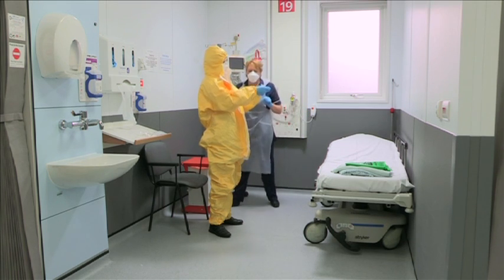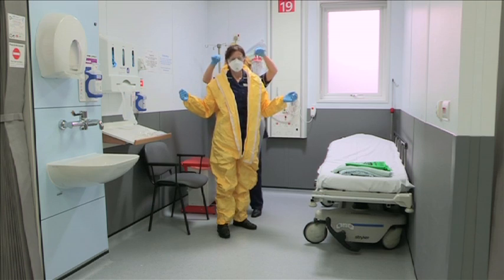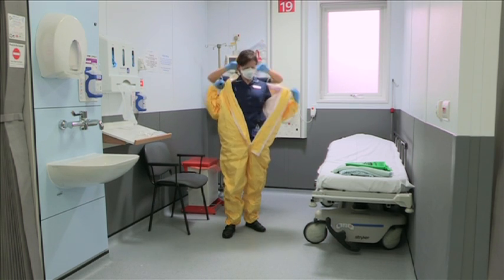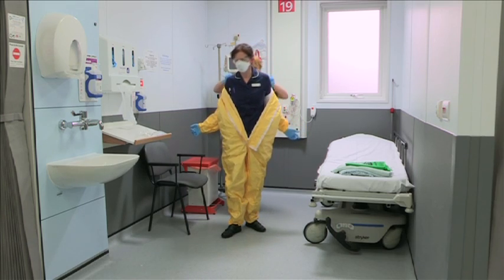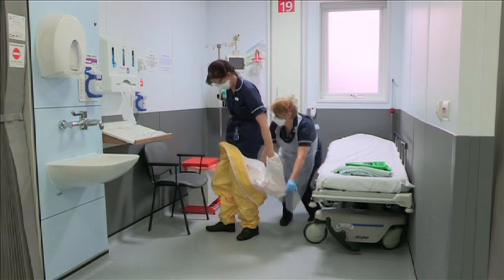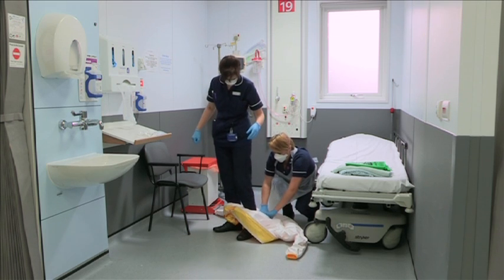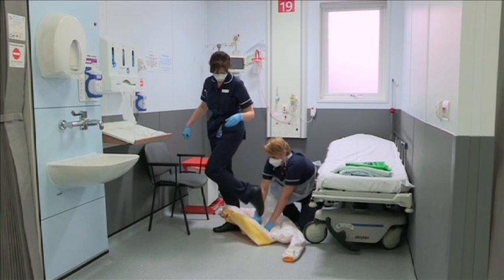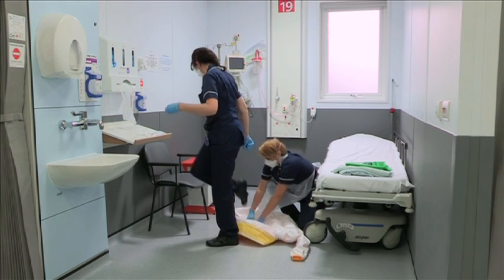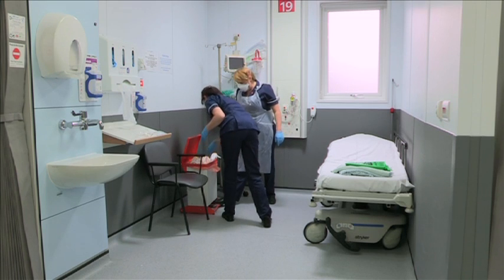Once the suit is loosened, the outer pair of gloves can be removed. Take care to avoid contact with the feet. Roll the gown inside out and dispose of.